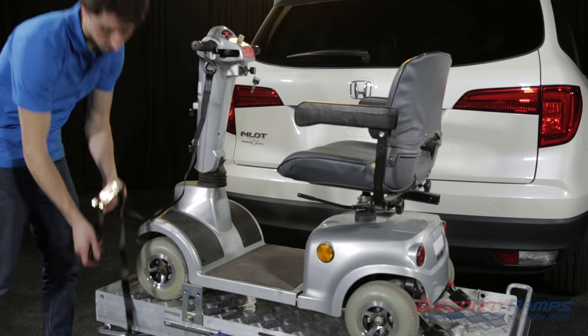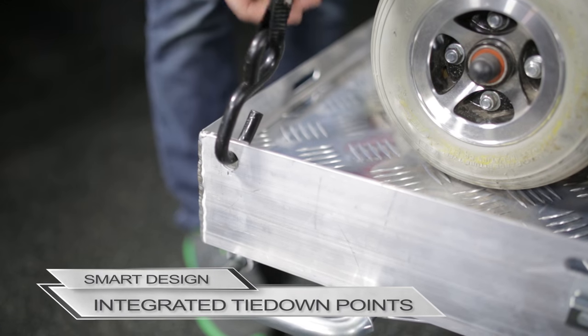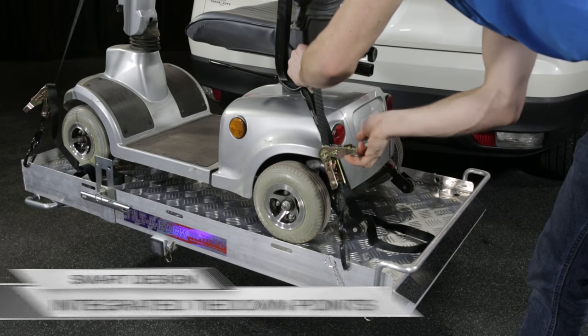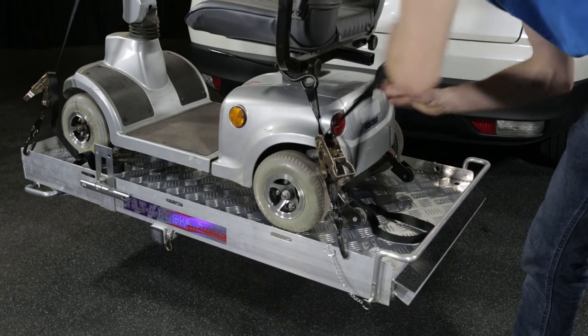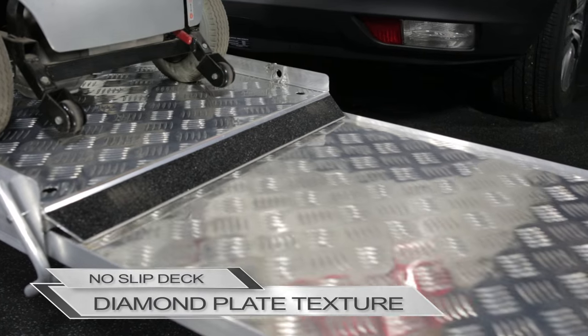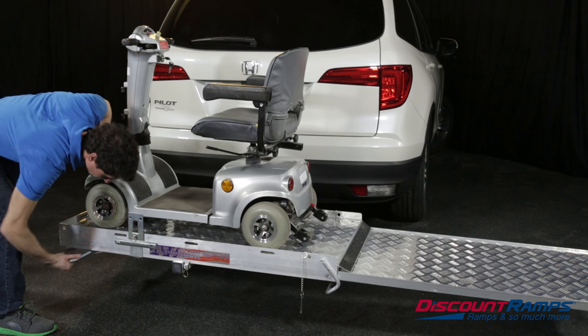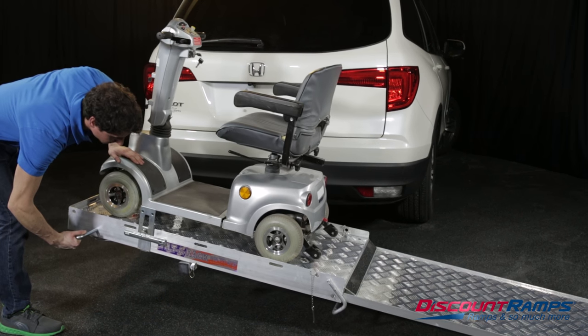Featuring multiple integrated tie-down points, you can quickly secure your mobility aid with ratchet straps to keep your scooter or wheelchair in place. Featuring a diamond plate texture on the platform and extension deck ramp, this carrier offers unmatched traction even in wet conditions.